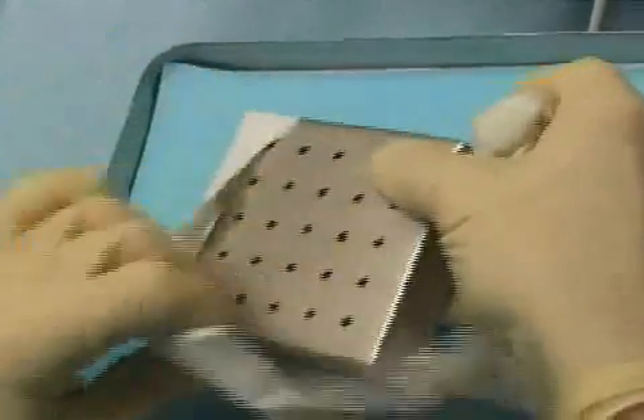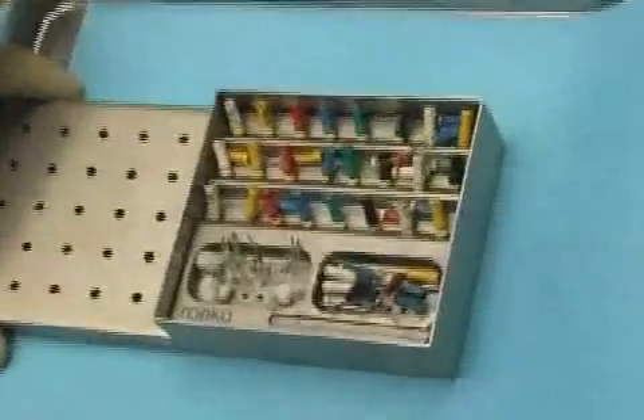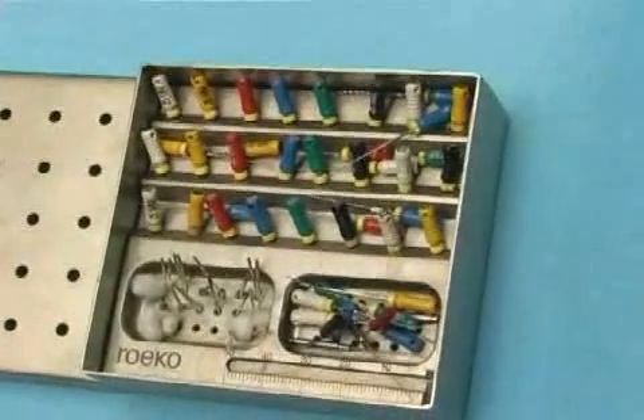It's important that the instruments used, and especially the lentilow, are sterile because you don't want to rotate bacteria into the canal. Here you see a demonstration of how a root canal box containing the clean instruments is taken out of the sterilizer and unpacked.